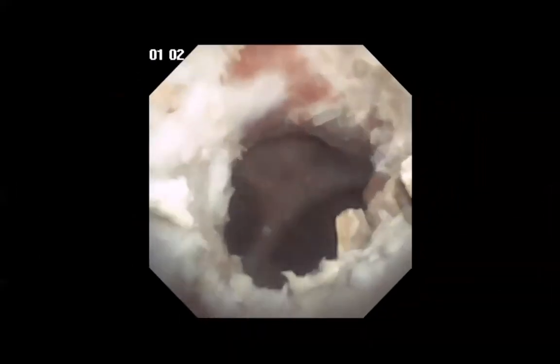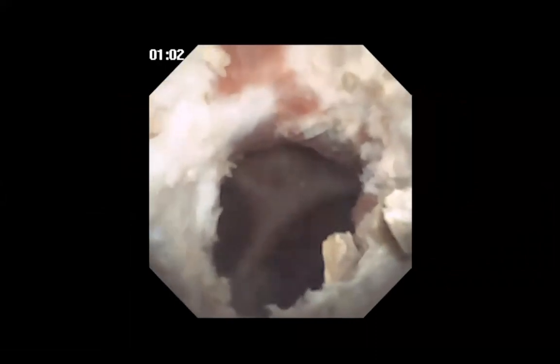Most of the remaining part of the stone was removed. You can see here the large parts broken from the stone, which are dusted very well with good vision and good brightness of light. This was the end result — most of the stone is removed. We have compound calyces in the lower part of the right kidney after removing all the fragments.